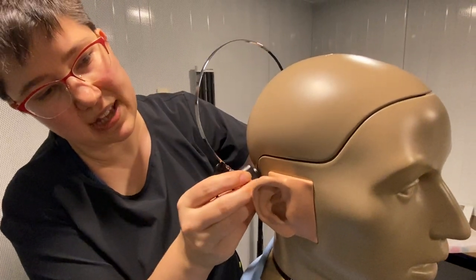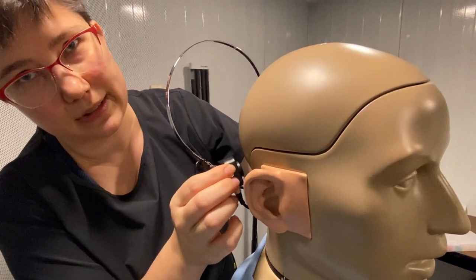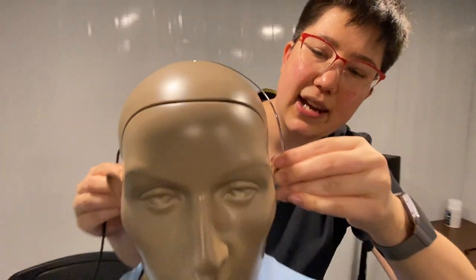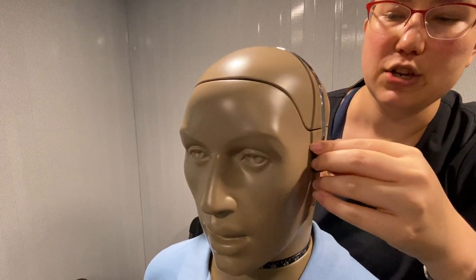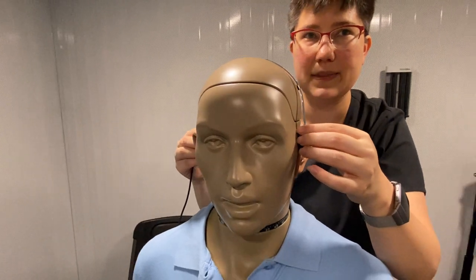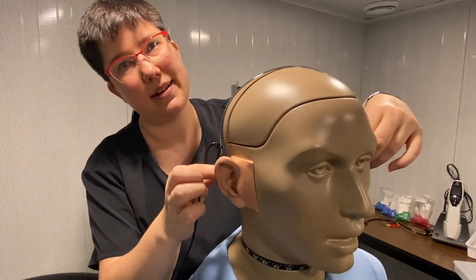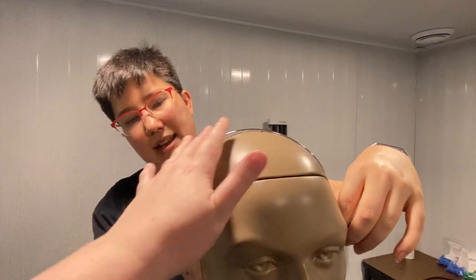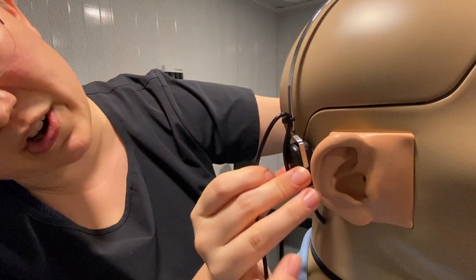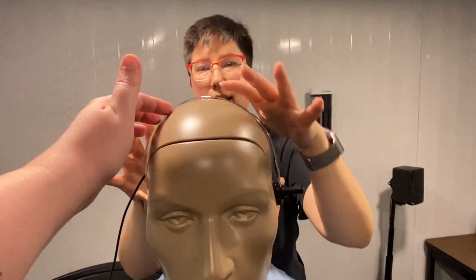You're looking for that prominent mastoid part. You do not want the oscillator to touch the pinna at all — not even a little bit. Hold it on, put a finger in between, come over the top of the head, and look for it to sit on the cheekbone side. You don't want it too close to the tragus on the other side, because if it closes that off, it's bad. Twist it so it follows the angle and curve of the head, running kind of parallel.